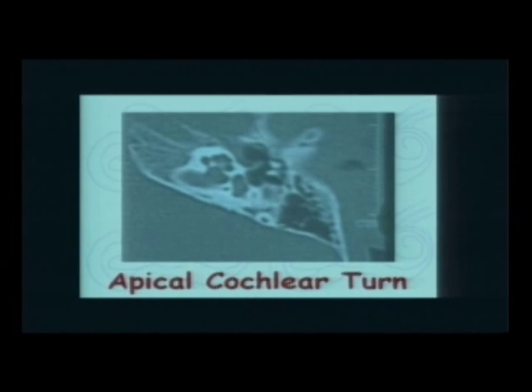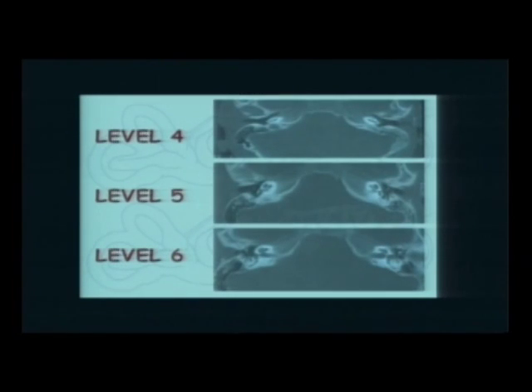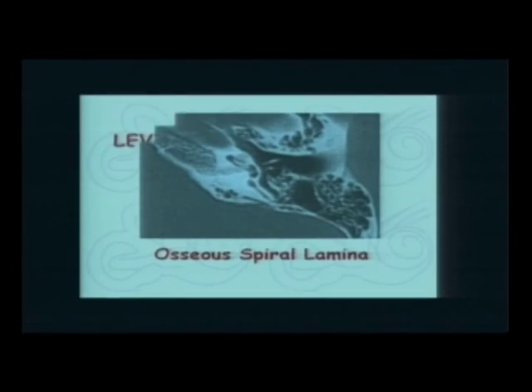If we go back two slides, we see that this is the continuation of the facial nerve in the tympanic part of the facial nerve, because we're coming from below upwards. So this is actually the beginning of the tympanic part of the facial nerve. And then you see in the middle ear here, in the attic, you can see the two ossicles. On the other side, they look nicely. You can see the head of the malleus, which looks like a ball, and behind it, you can see a triangular bone, which is the incus.